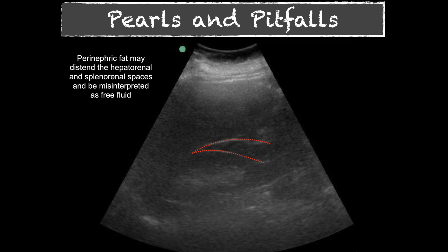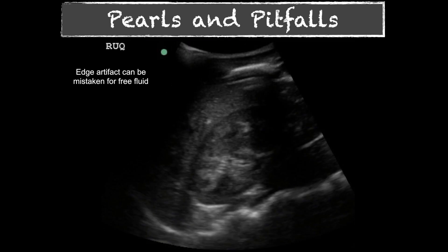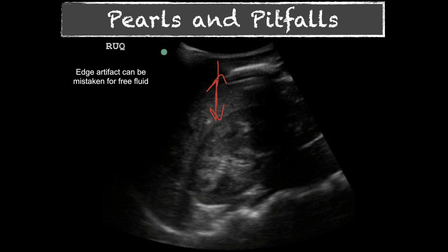Another thing often mistaken for free fluid is edge artifact. Because the kidney has a curved surface, some ultrasound beams are deflected away from the probe rather than returning to it, creating a dark area that can look like fluid. This is edge artifact and typically occurs at curved edges. You'll see it around kidneys on FAST or renal exams. That black stripe does not always mean fluid — you really need to ask whether it's edge artifact based on the angle and location.